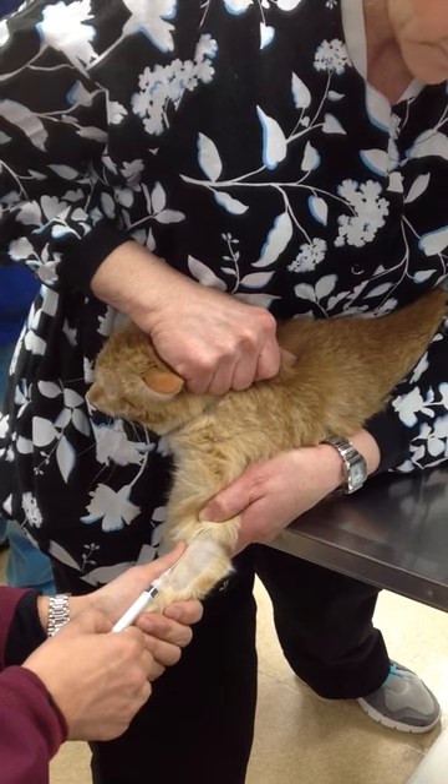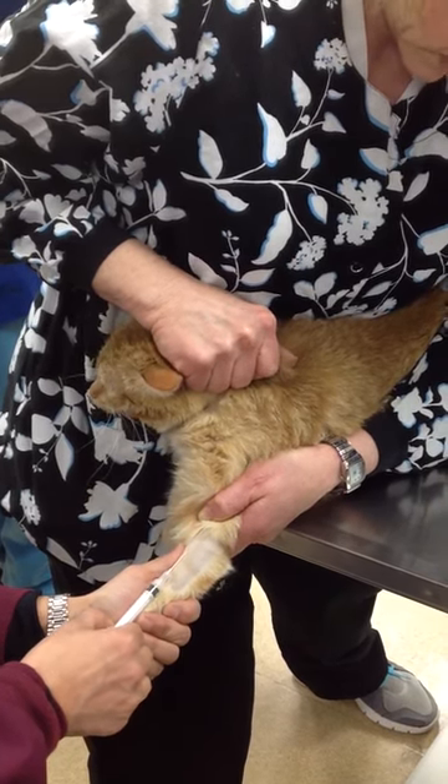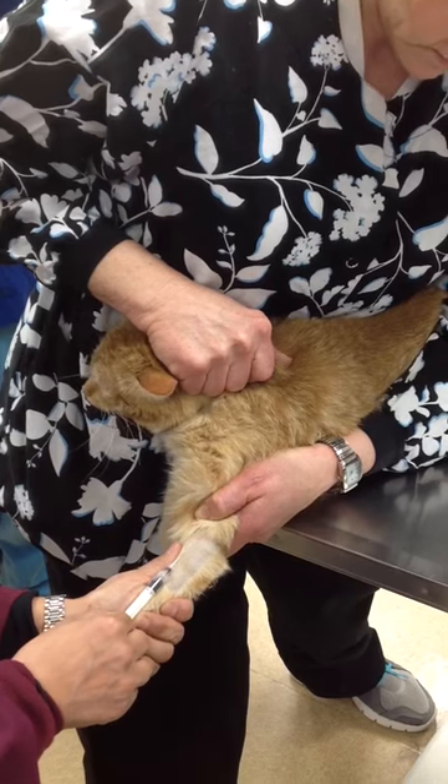Terry, are you ready? And then I'm just going to keep my angle very shallow and advance my needle. I'm still stabilizing my syringe with my middle finger of my left hand.